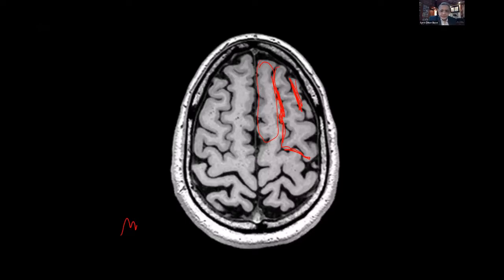Now the central gyrus, central sulcus, is this one, though it's not so clear over here. And remember, the central sulcus typically has this omega sign, or hand knob sign, that you will see, but you don't see it over here, do you? No, you don't. You cannot always see it, but if you see it, it's very obvious.